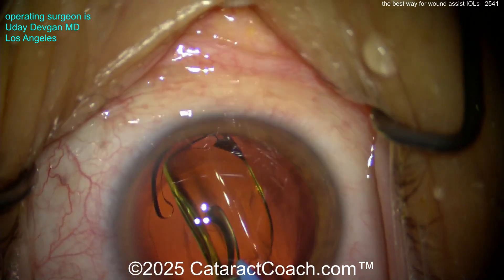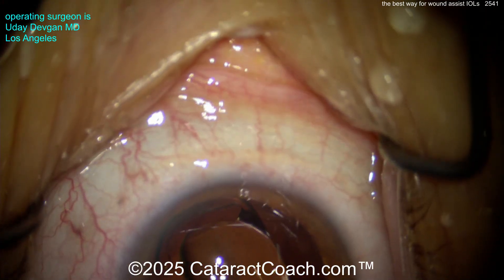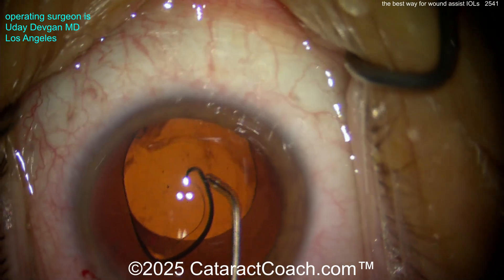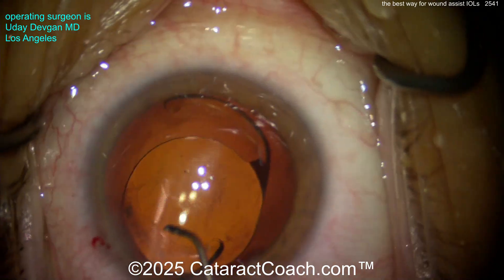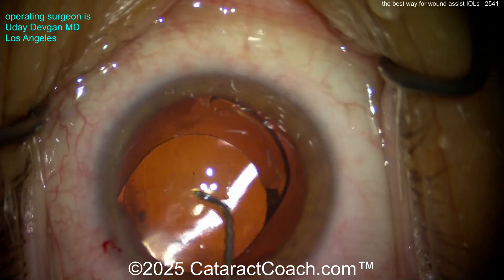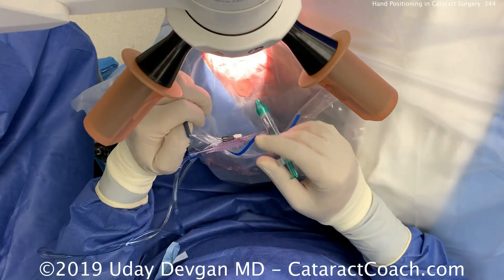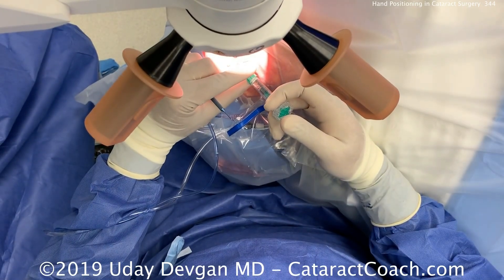The big challenge is when you use a two-handed injector — both your hands are on the injector, so the tendency is to shove the eye into the nasal canthus. You don't want to do that. A little bit initially is fine, but as soon as the lens starts to go in the eye, get it back to primary.